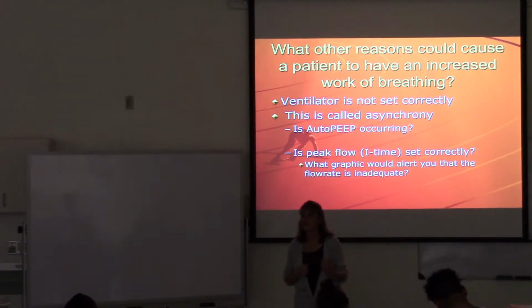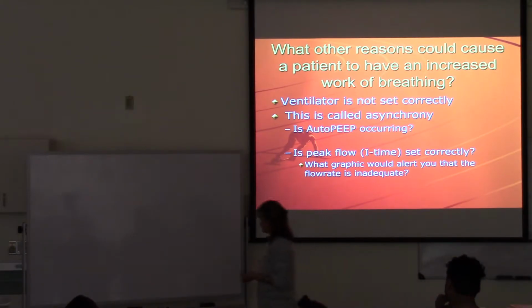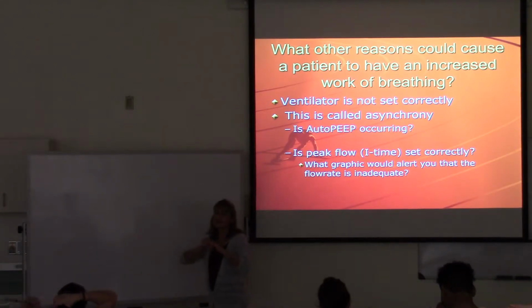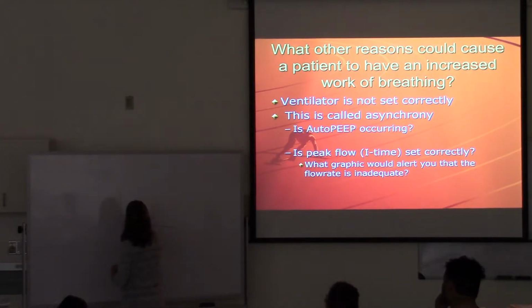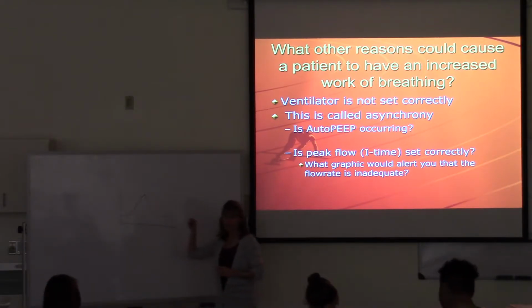And then you guys have to help me figure out a word. It won't rise. It won't be. It'll what? I can draw the picture. How it won't build? Yes, it won't build. So pressure normally should keep rising throughout inspiration.